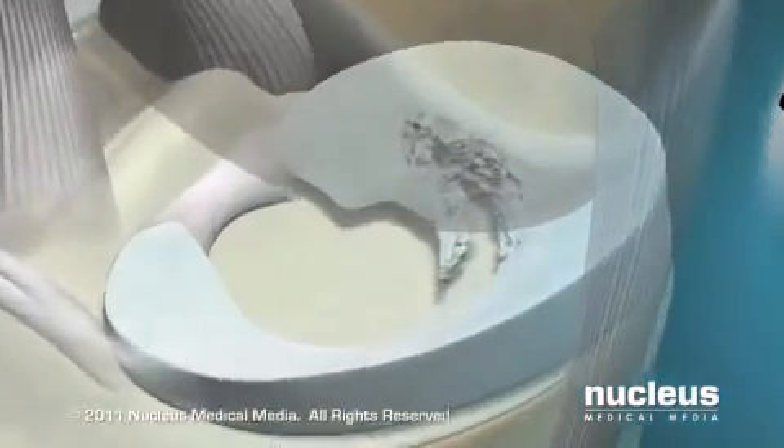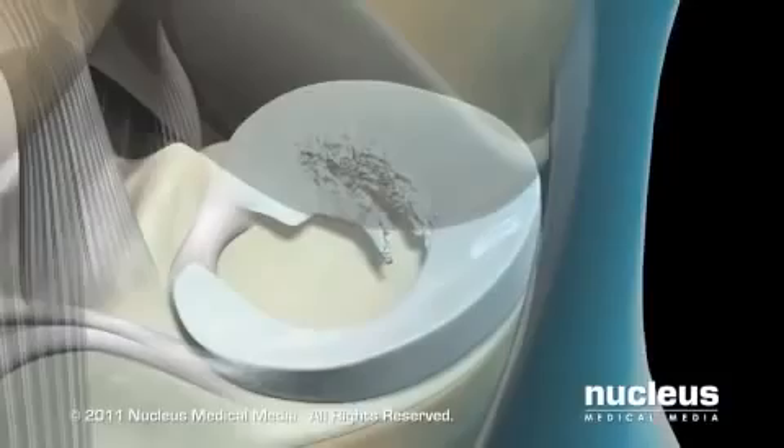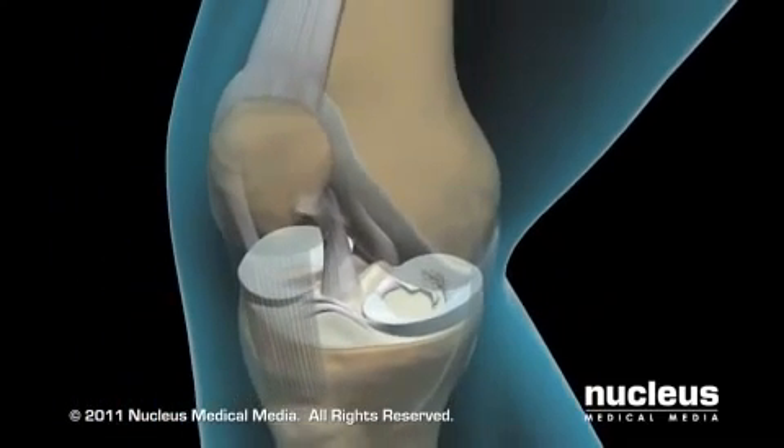Injuries or arthritis can cause the menisci to become torn, resulting in knee pain, swelling, and diminished range of motion. Knee arthroscopy is often performed to remove the damaged portion of the meniscus.